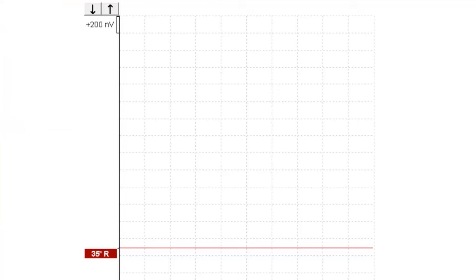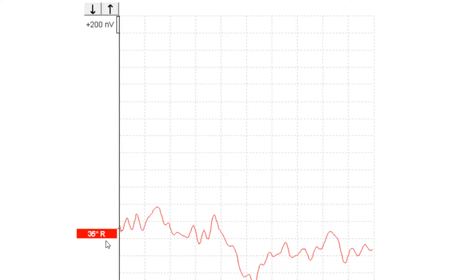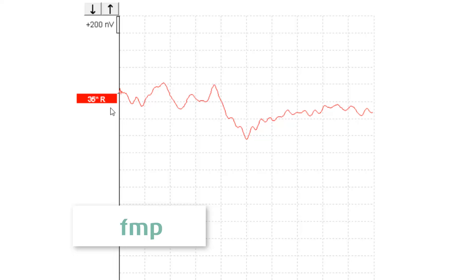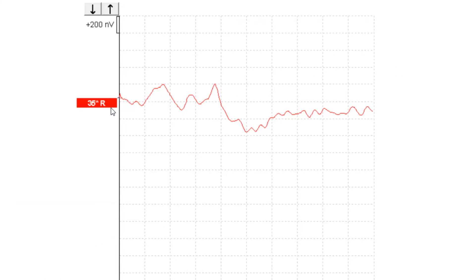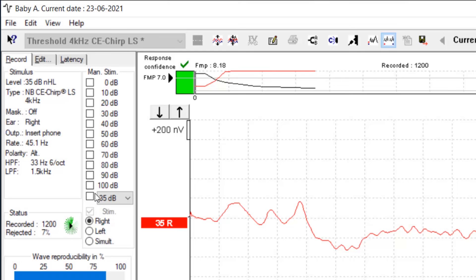In addition to eyeballing the waveform morphology and using the expected latency and amplitude values and latency shift, there is some objective data provided within the Eclipse software that can help inform whether a response is present. The FMP value is a statistical calculation of the likelihood of a response being present, and is totally independent of waveform marker placement. However, you must record a minimum of 800 sweeps for this calculation to be valid. Typically in newborns, we are looking for an FMP value of over 7. In this case, we have recorded over 800 sweeps and our FMP value is over 7, so we can stop testing. We do also have a good morphology, which is further support for the presence of an ABR.